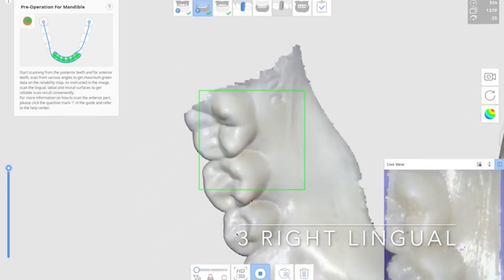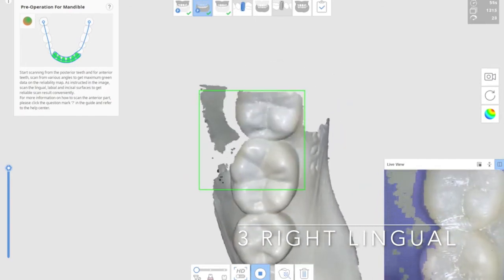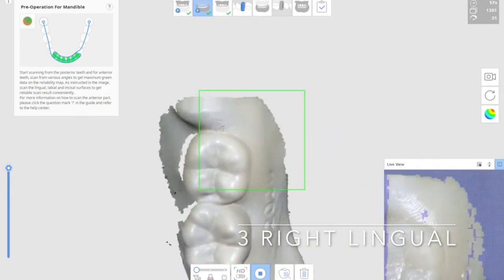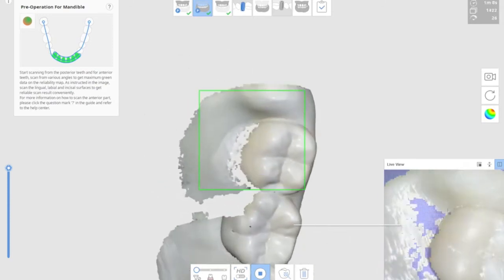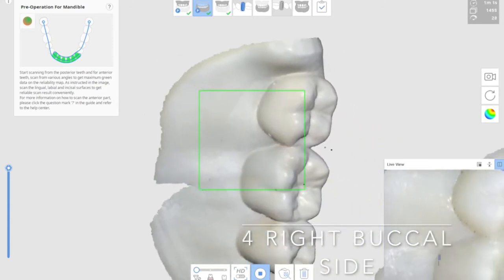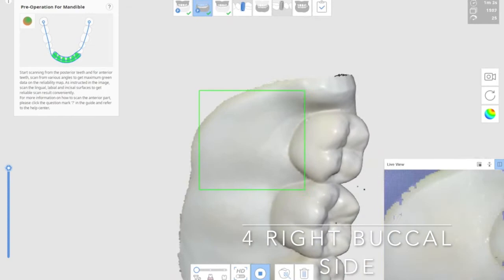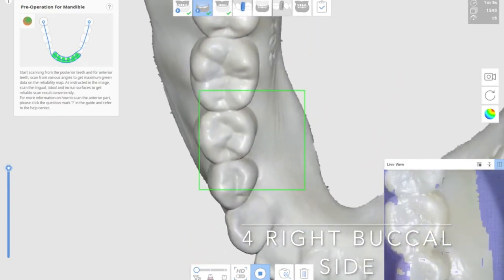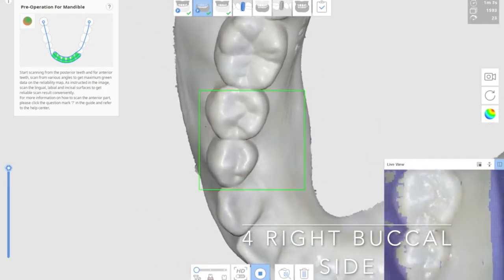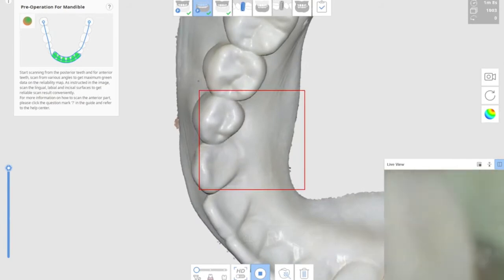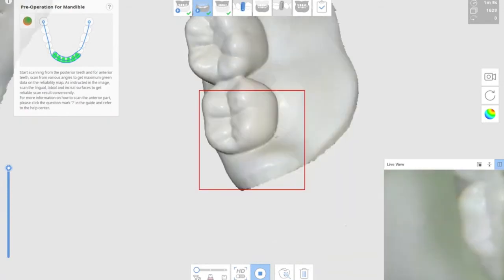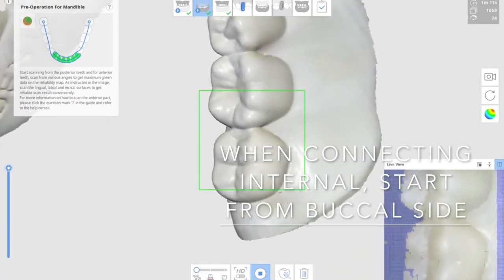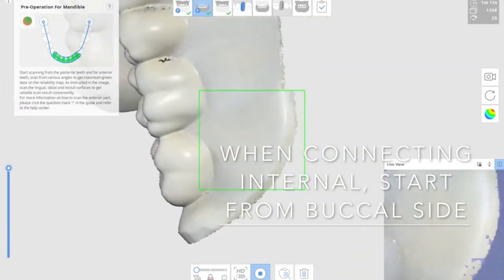Occlusal view and the lingual, move on all the way to the distal part. And then the last one is the right buccal side of the try-in will be scanned. Once you complete the polished surface, which is buccal, lingual, and occlusal surface.